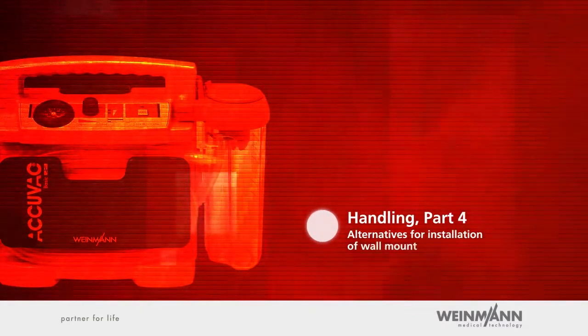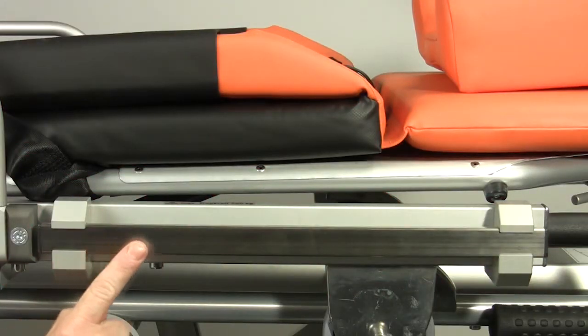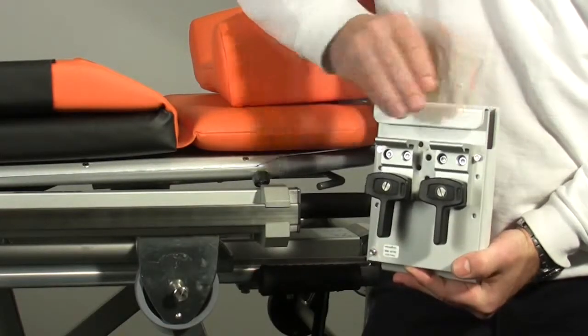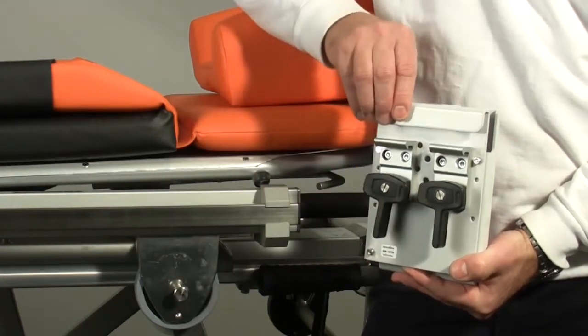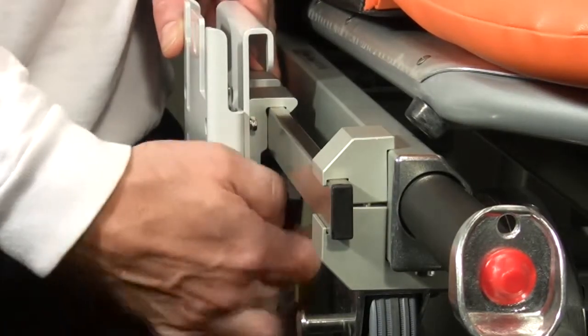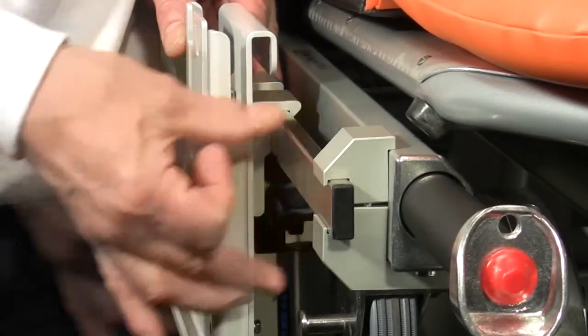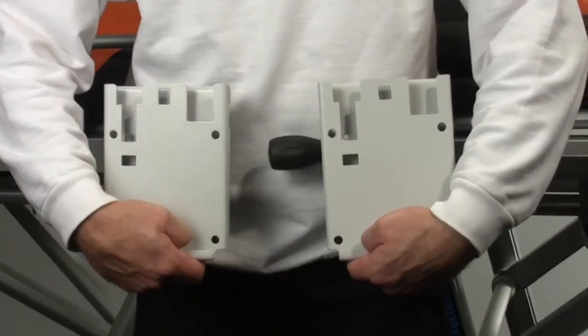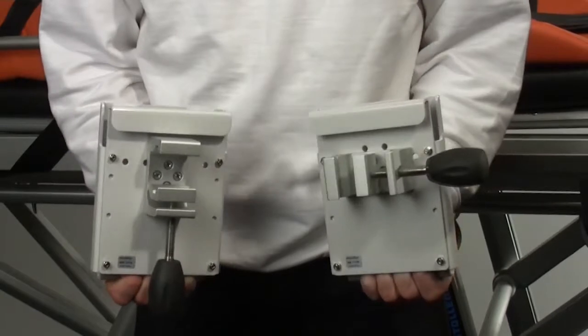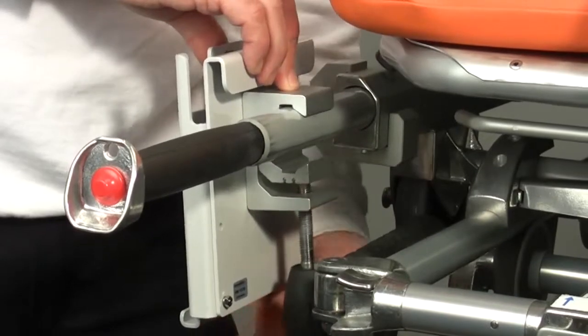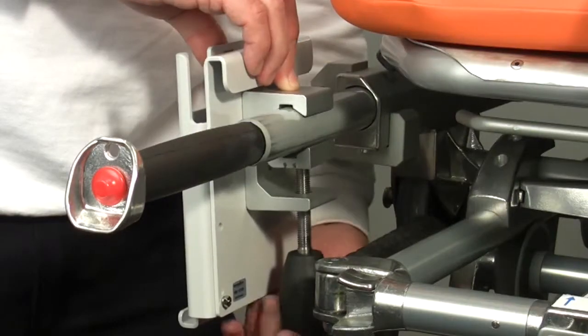Handling, part four: alternatives for installation of wall mount. The wall mount can be equipped with appropriate clamps to attach AcuVac Basic to standard hospital rails. The wall mount can also be equipped with a screw-on pole mount. These options let you fasten the device to horizontal and vertical poles with a diameter of up to 40mm, for example, on the side rail of a stretcher.